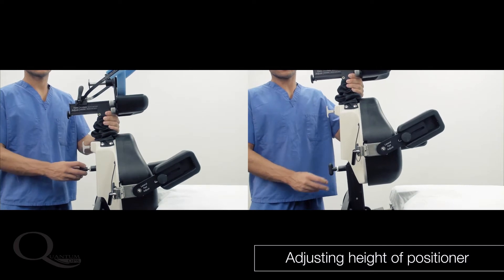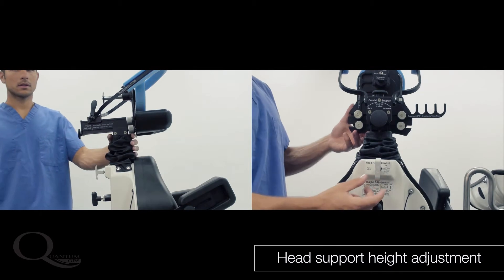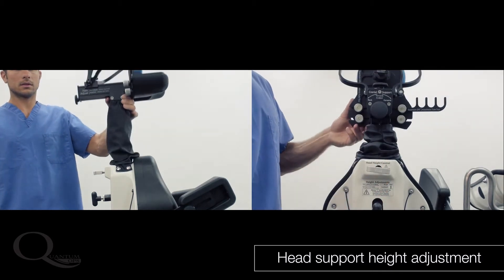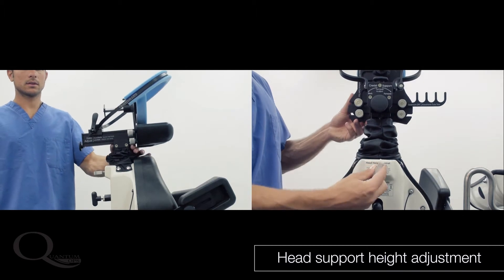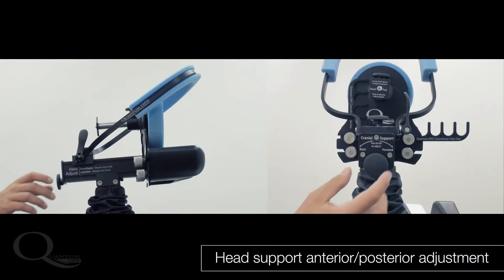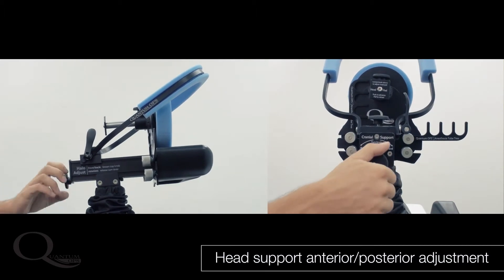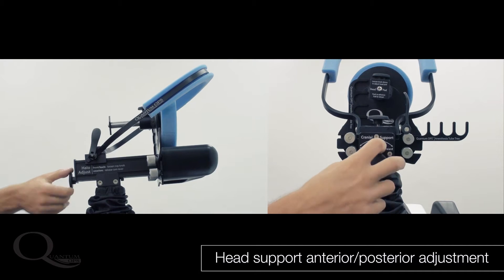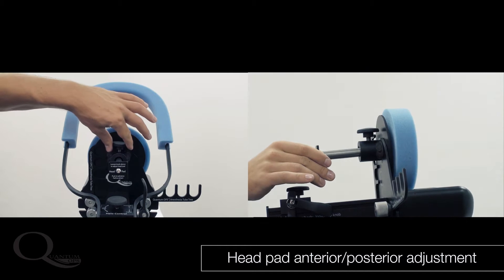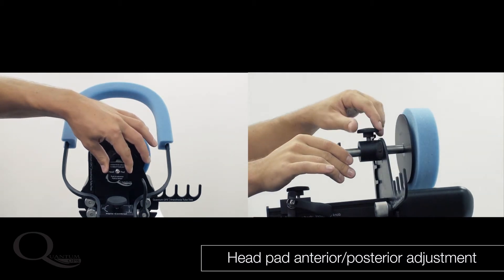The floating head support is unique to the Quantum positioner and should be allowed to float while the patient is being raised or lowered, then locked when the operative position is achieved. The head support can be adjusted anterior and posterior to accommodate patients with different neck curvature, and especially those with kyphosis. The entire head support can be shifted anterior and posterior, or the head pad alone can be shifted anterior and posterior using the simple knobs.